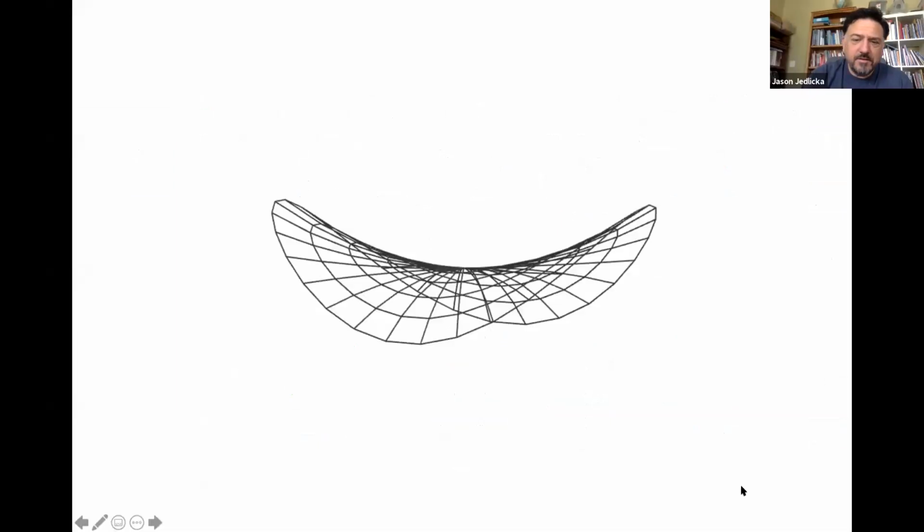All right. So we have this notion in our head of the cornea looking like a Pringle, because we know that it's not the same diameter in both meridians, and we also know that generally it's not the same elevation in both meridians. But the reality is, it doesn't really look like a Pringle, right? It's still a hill, and so the area that's elevated is not really elevated.